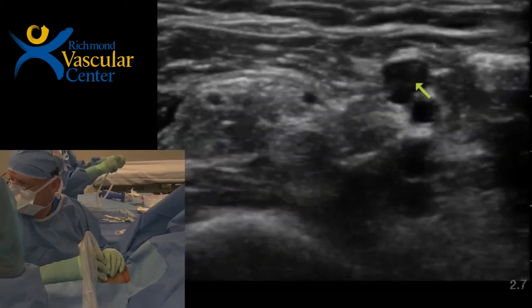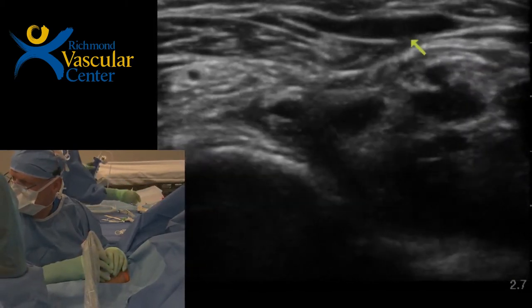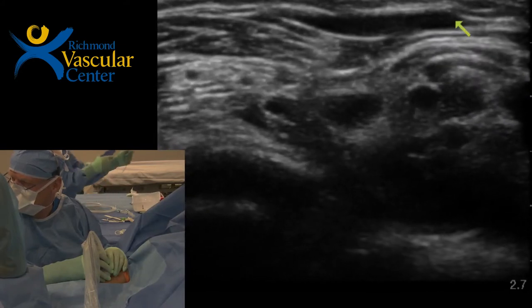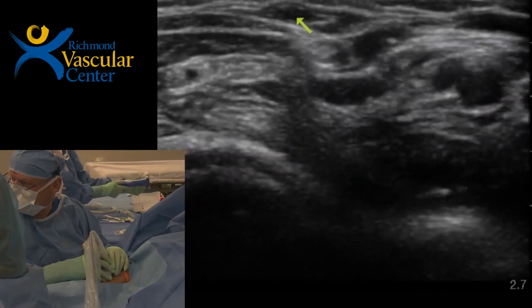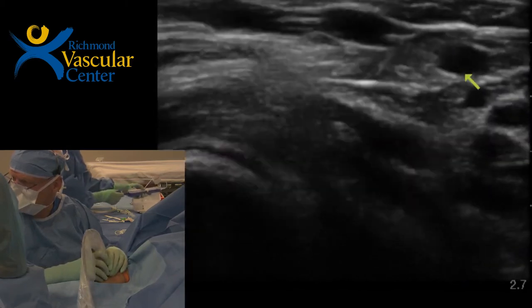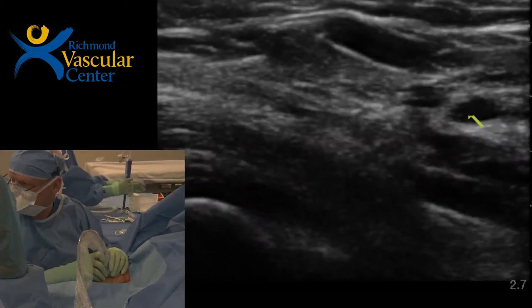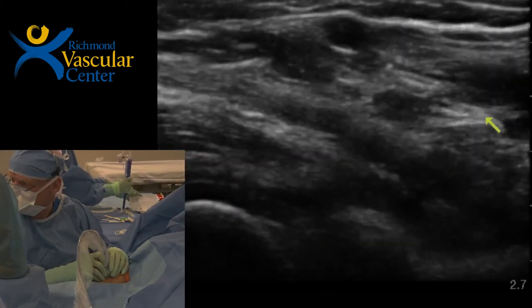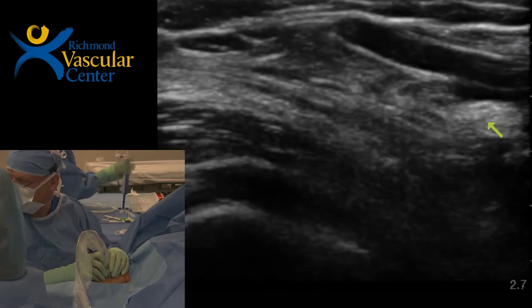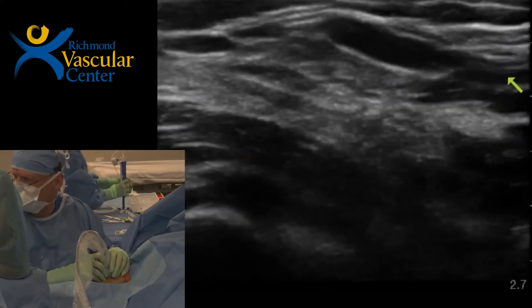So then we follow the perforating vein up. And then it splits into the basilic, which is over there, and the cephalic, which is over there. So they sort of splay. So let's go long on this. And you can see that's the perforating vein before it, and that's probably right about where it bifurcates.